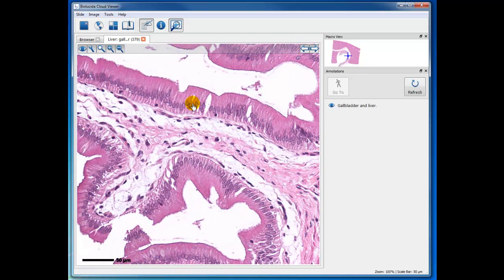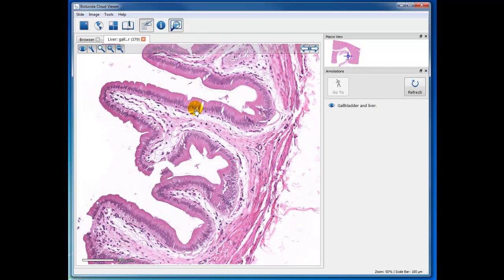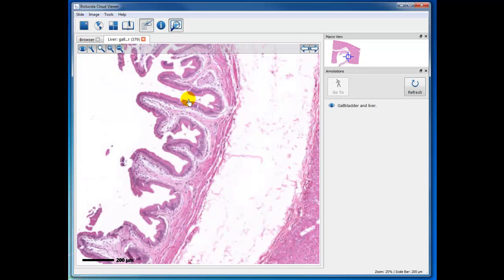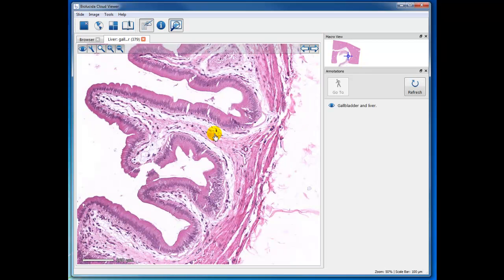Remember, the gallbladder has tall, simple columnar epithelial cells that absorb water, because the gallbladder stores bile, which is really bile salts. It's a detergent to pour into the duodenum to emulsify the lipid and the fat that you take in your diet. But there are no goblet cells here at all. That's one diagnostic feature. It looks like a villus, but if you look, there are absolutely no goblet cells anywhere, and there are no intestinal glands.